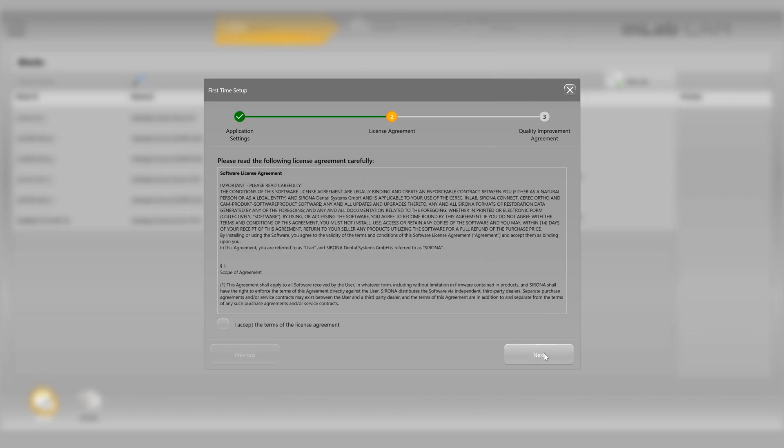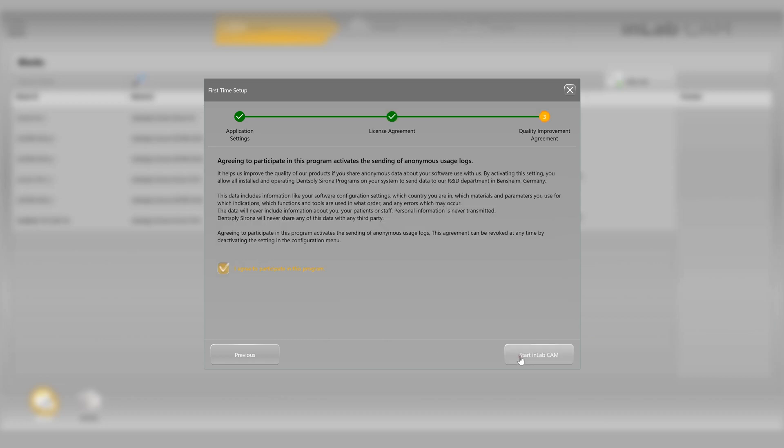The next screen will be the license agreement. Please review it, accept by checking the box and then going to next. Then agree to participate in our quality improvement program.